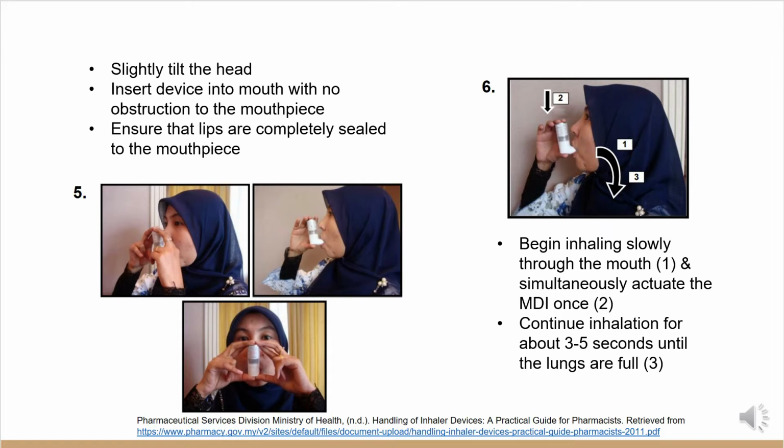However, there are some patients who have difficulty doing steps 1 and 2 simultaneously. So what they can do is use a spacer, where this spacer will provide enough time for them to inhale the medication after pumping the inhaler.